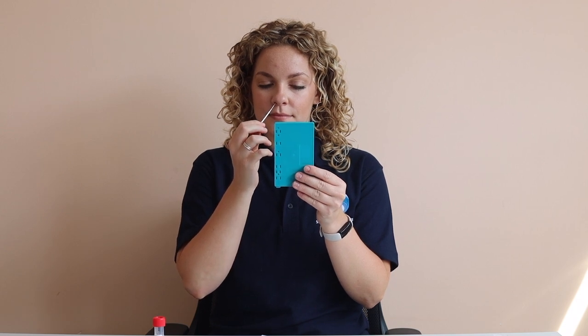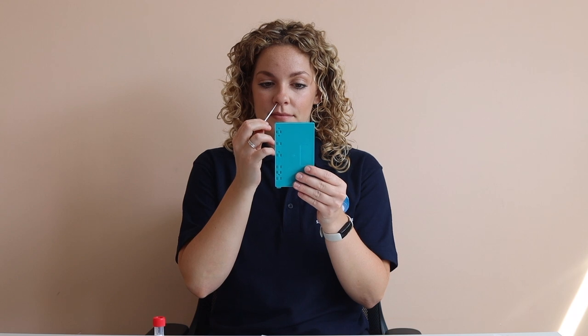Using the same swab, carefully insert vertically into one nostril, approximately two to three centimetres. Rotate the swab five times, then leave it in position for five to ten seconds.